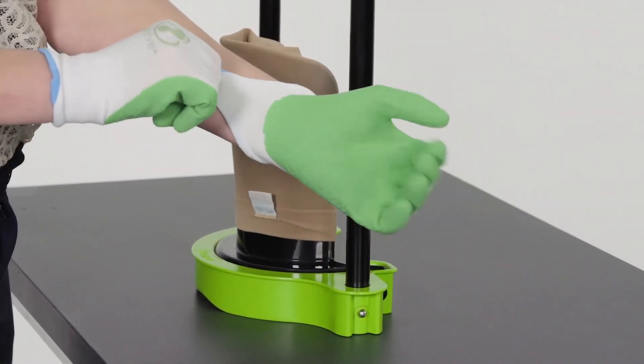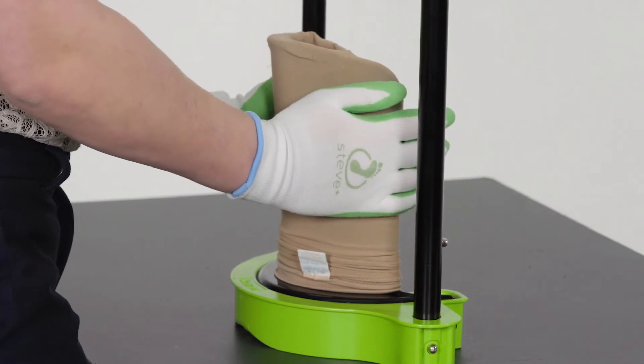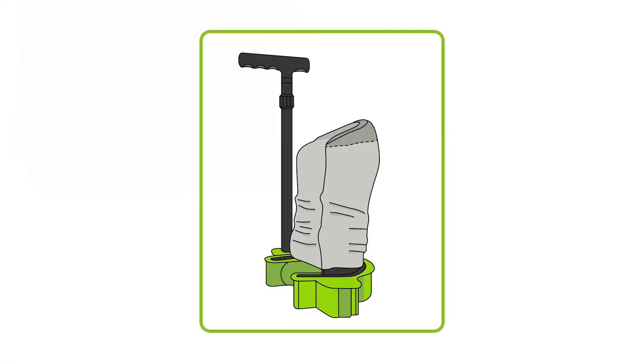Place your hands around the donning shovel and roll the stocking down evenly until the heel of the stocking is placed halfway over the edge of the donning shovel. Check if the heel of the stocking is located in the middle.